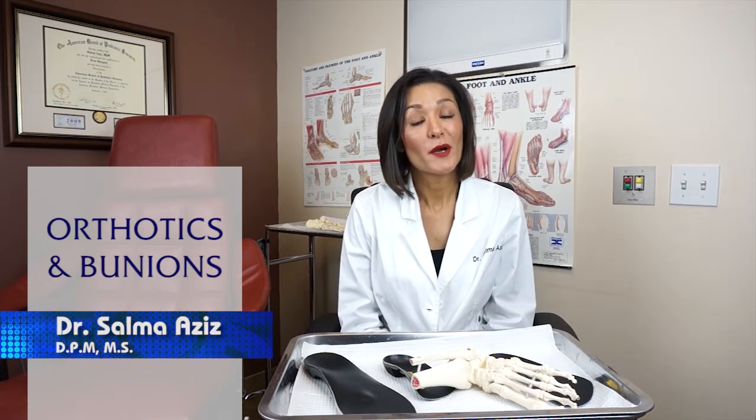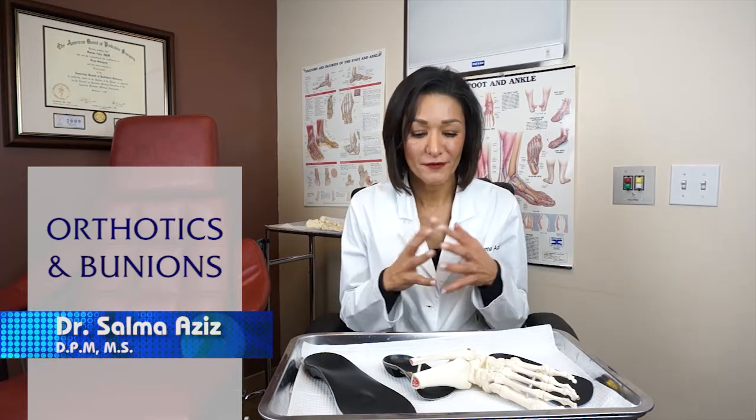For those of you that missed the video on orthotics, a quick recap. We're talking about custom orthotics that are fitted for patients based on taking a mold of their foot and making the specific orthotic for their shoe type and activity level, so that it has a very custom, good fit to it.